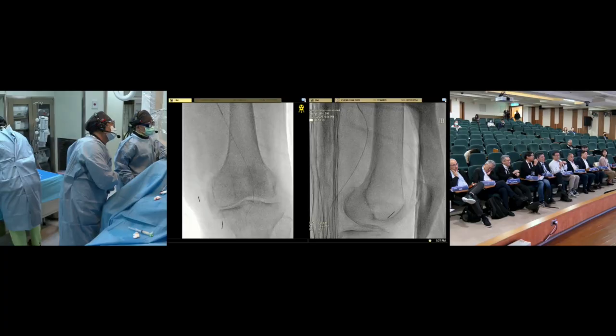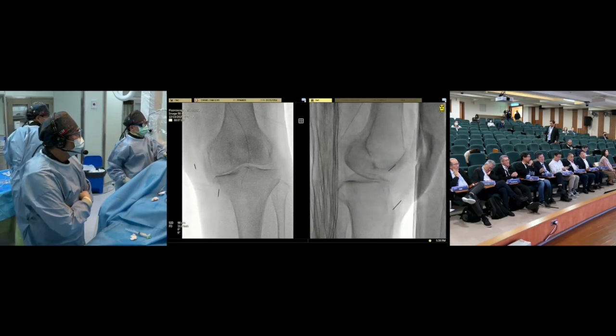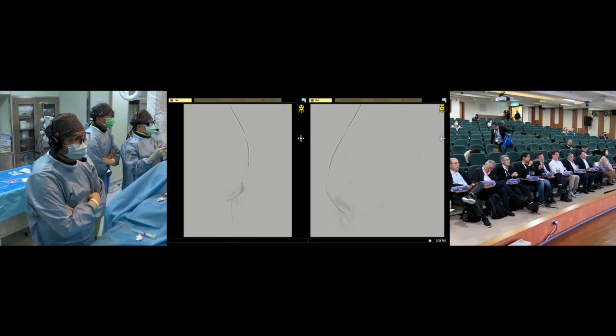Dr. Wang, I'm Wu Dianyu from Xinguang. Two questions. Is there any heparin needed during the procedure? This is the first one.